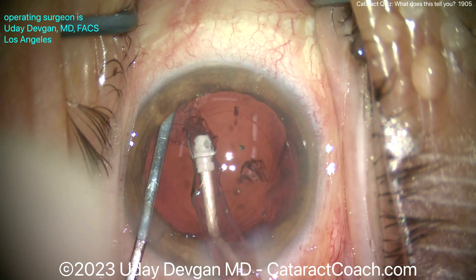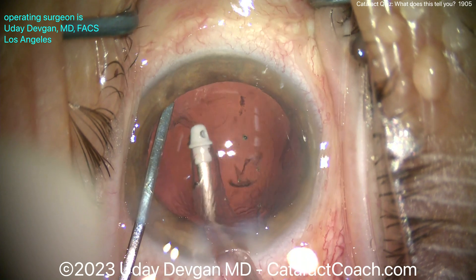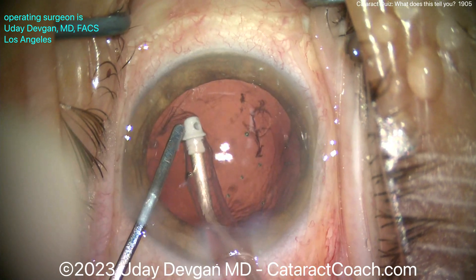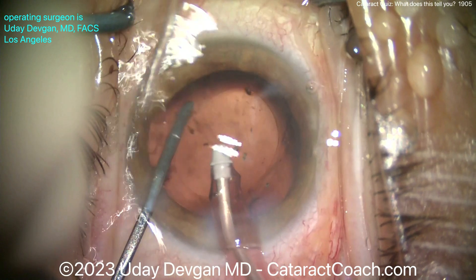There it is — counter-traction against the rhexis with the spatula. I can use that I/A probe and gently remove that cortex. That looks pretty good.